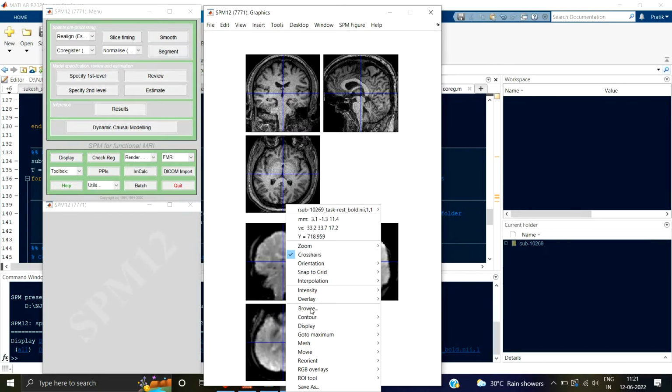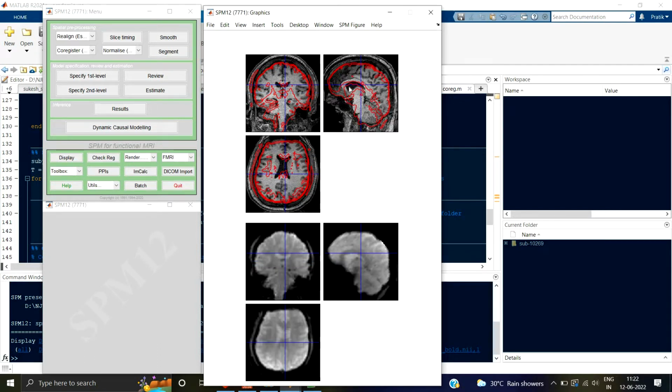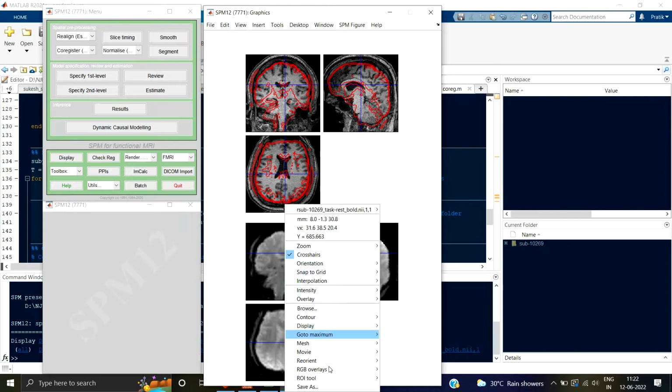Let me just show you the contour. Here you can see I've overlapped the contour of this image on this anatomical image, right? Now if you see closely over here, you can see that this red contour is actually a little downwards. Can you see that? I can also change the location so you can see it more clearly. This line is very far down as compared to this particular thing, right? Here they have been co-registered, but the co-registration output is not that good. There are some small but noticeable differences that you can see. The first way that you can rectify this is by using something known as reorient.